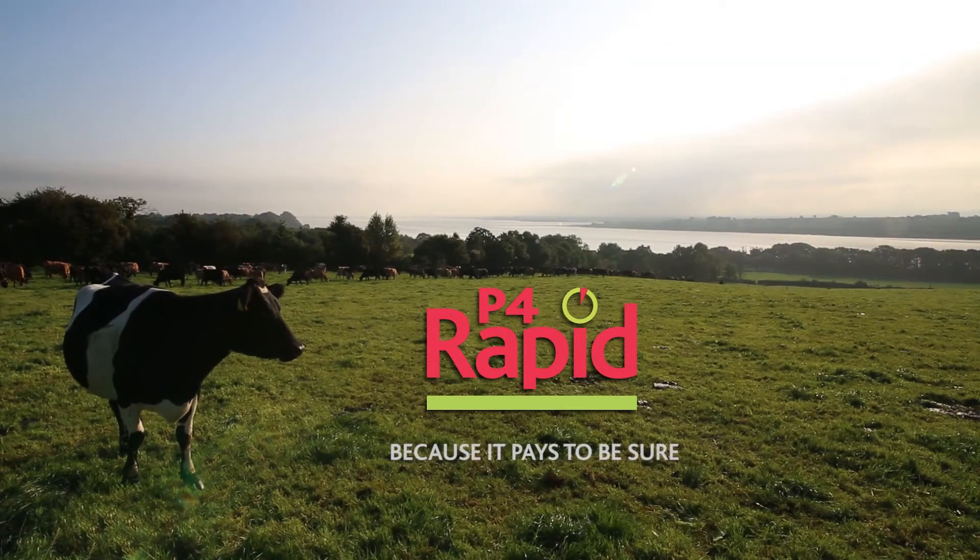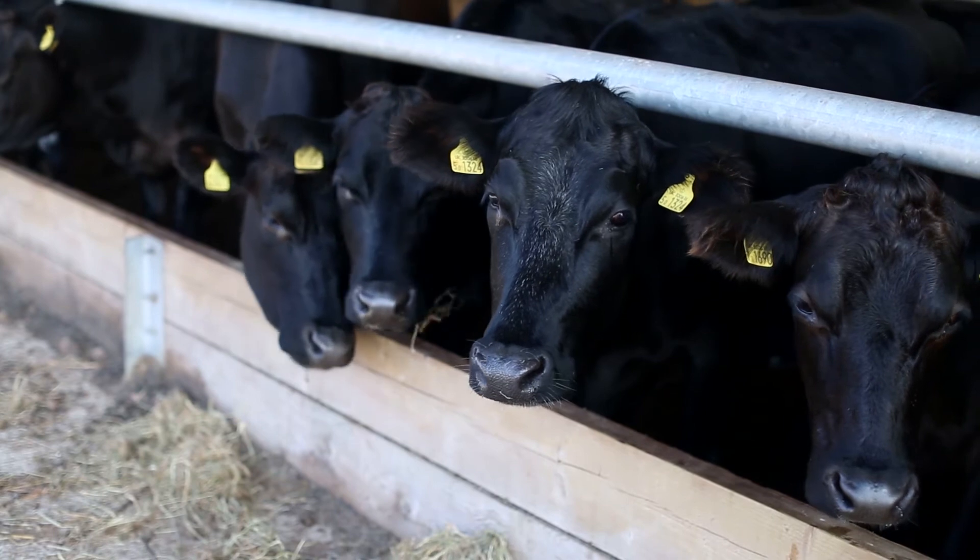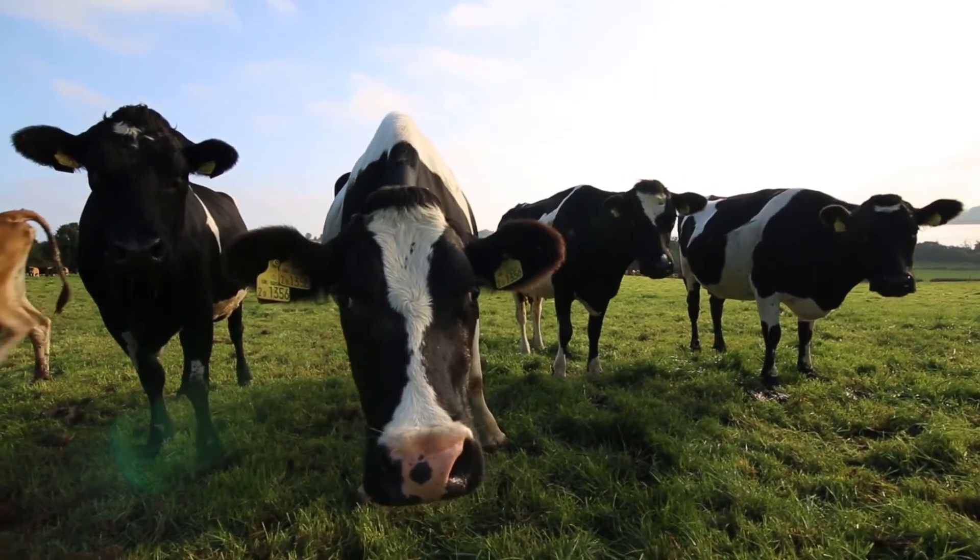P4RAPID is an in-milk test that will confirm if your cow is in heat. It's fast, accurate, and easy to use. Here's how.